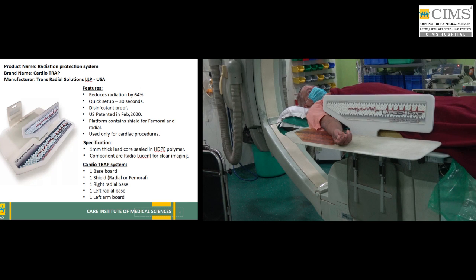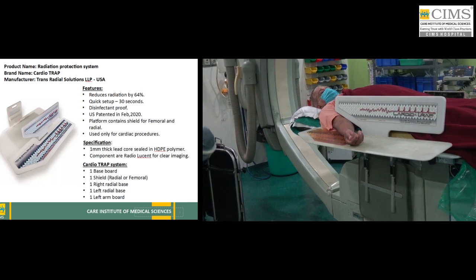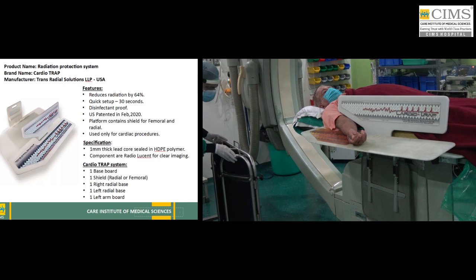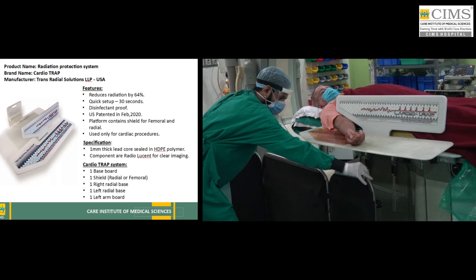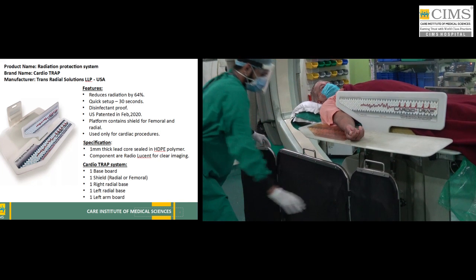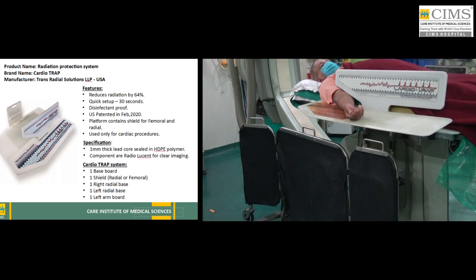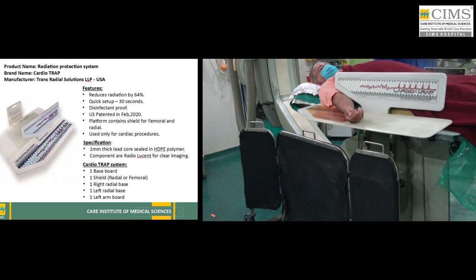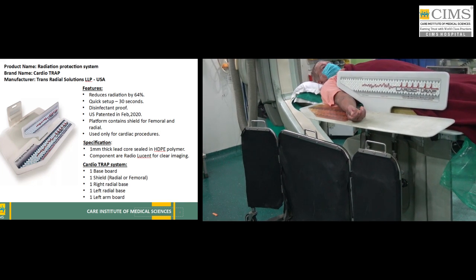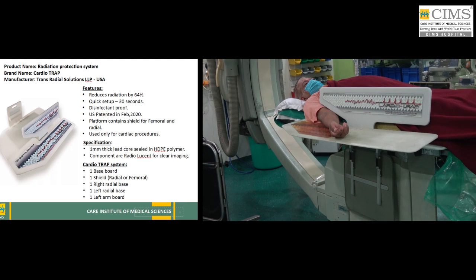Also we have a sliding lead shield, the one you see in the black, which is covered, and right next to it you also see a gray lead shield, which is permanently hanging from the table. So as you see, we have 1, 2, 3, 4. The 4th one, the radiation pad, is still yet to come, which you will see when the patient is prepared.